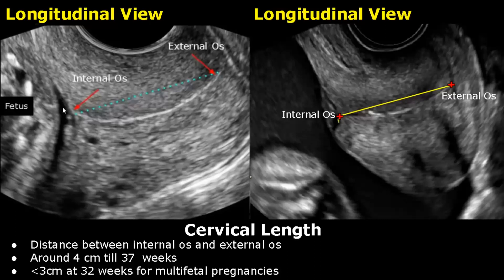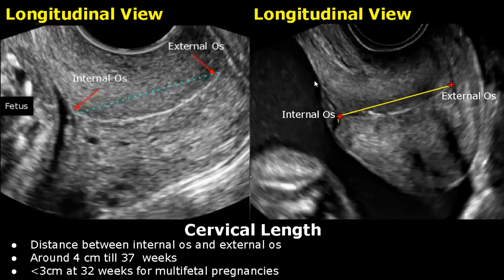The transvaginal approach is the most accurate approach for measuring cervical length. The cervix is seen in longitudinal view. One caliper is placed at the internal os, right here — this junction that is towards the fetus, in the left half of the image. And the other caliper is placed right here, at the external os.